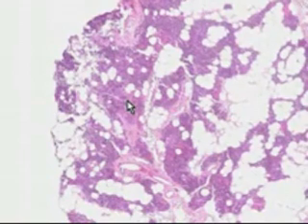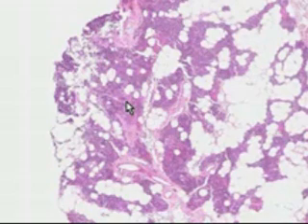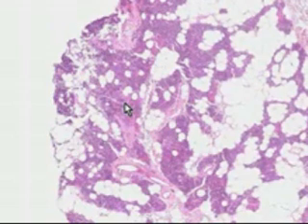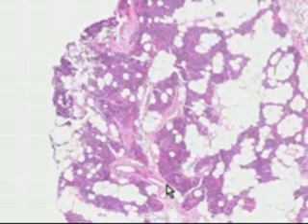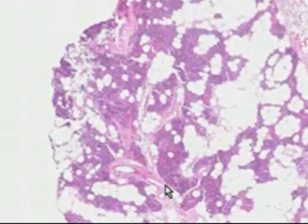Here is a parathyroid. Parathyroid glands are very small. They only weigh about, let's say, 25 milligrams. As you can see, often, and certainly in this case, half of this is fat as well. The parathyroid gland produces one hormone called parathyroid hormone. It has exactly the opposite effect of calcitonin from the thyroid.